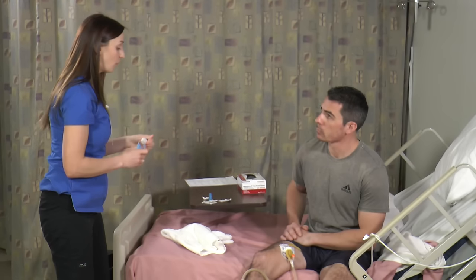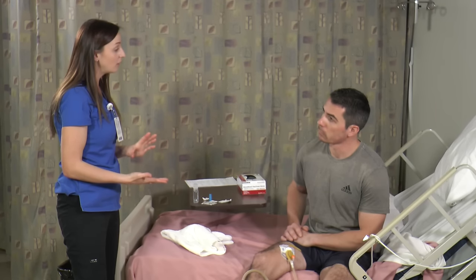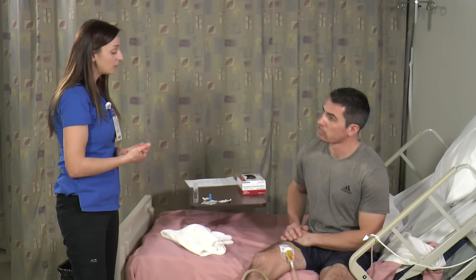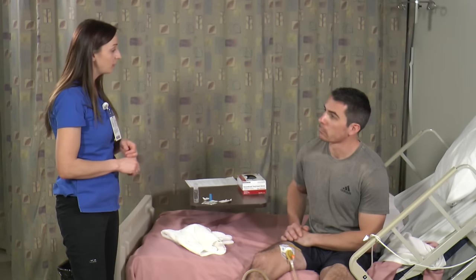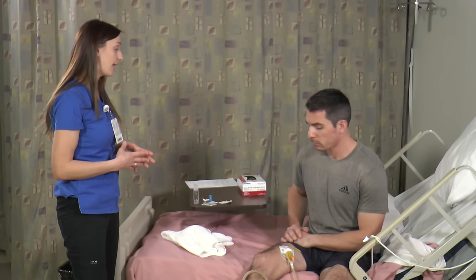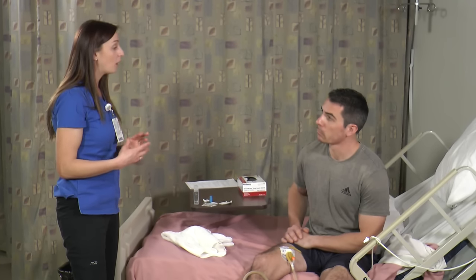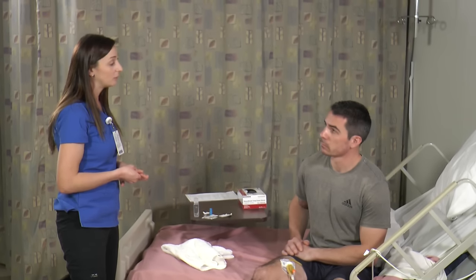Okay? Okay. All right. So we want you to avoid having any urinary tract infections. A couple of ways to avoid that are to, one, ensure that you're always washing your hands prior to and after care. We'd like you to limit the amount of times that you're changing from your leg bag to your gravity bag, and make sure that you're performing proper catheter care, which includes making sure that you shower and do not take baths. When you clean the catheter site, you want to clean it at least once a day with a mild soap and water, and pat the area dry. Next, make sure that you are pulling downward when cleaning and never pulling back up towards the catheter site, so as to limit the amount of bacteria entering the urethra. Also, do not apply any ointments or creams unless provided by your urologist.